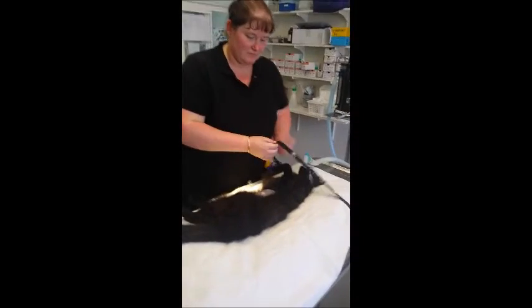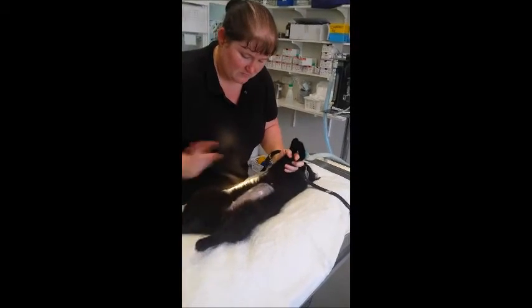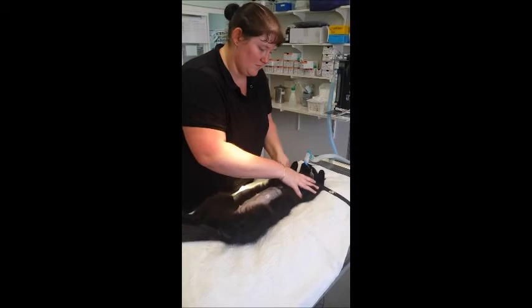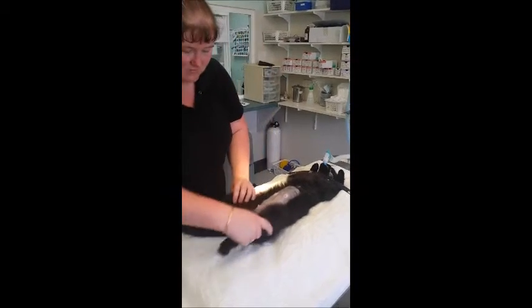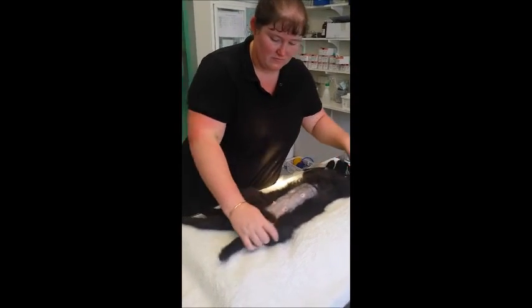I place the patient in dorsal recumbency with its head towards the anaesthetic machine, then use restraints to hold the patient in position. When using restraints for theatre, always ensure they are not going to get in the way of the surgeon, affect any monitoring equipment, or upset the respiratory rate of the patient.